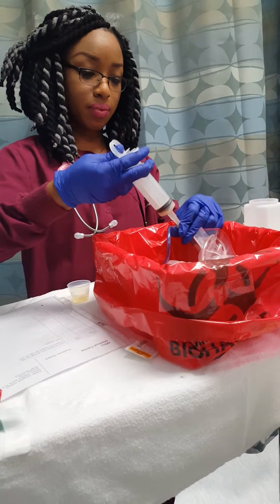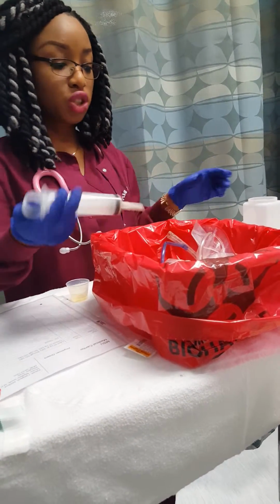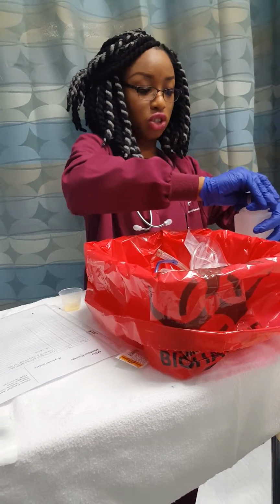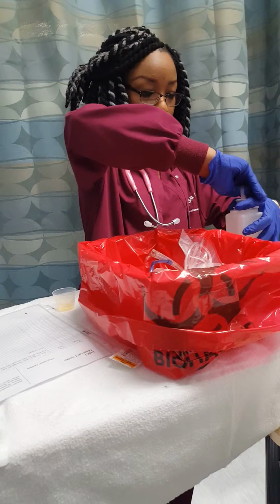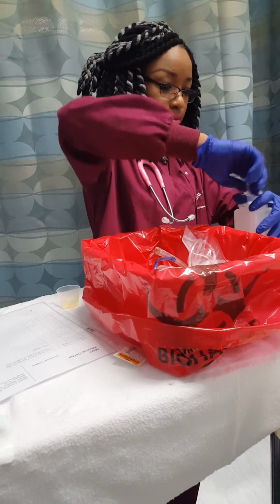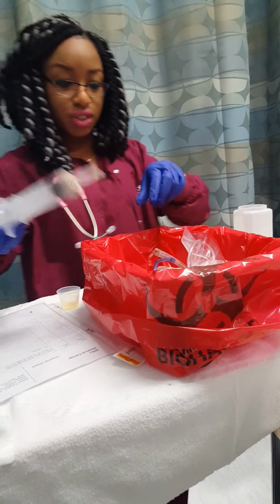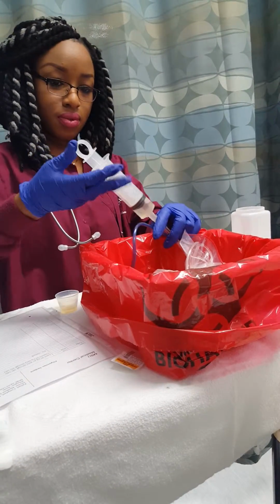Gonna put it back in there. Going to flush with 30 cc's of normal saline, and also that's just for the electrolyte balance. All right, 30 cc's of normal saline. It's a little hard to push, so I'm going to flush it in.